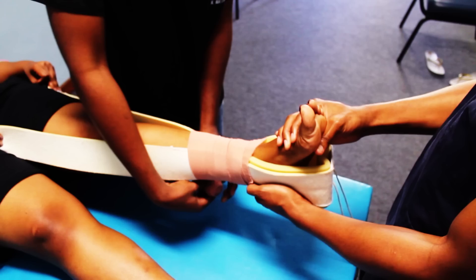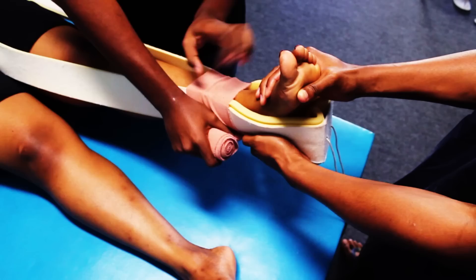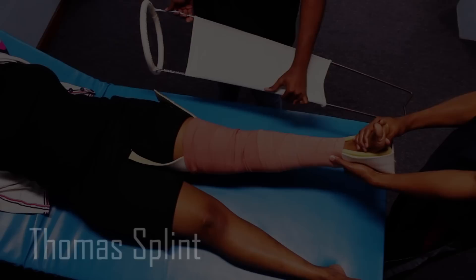The technique demonstrated here is the 50% overlap method. Alternatively, you can use the figure-of-eight method, which ensures more tensile strength. You want to apply all the way up to the level of the groin, making sure that it's not too tight to prevent the development of compartment syndrome.